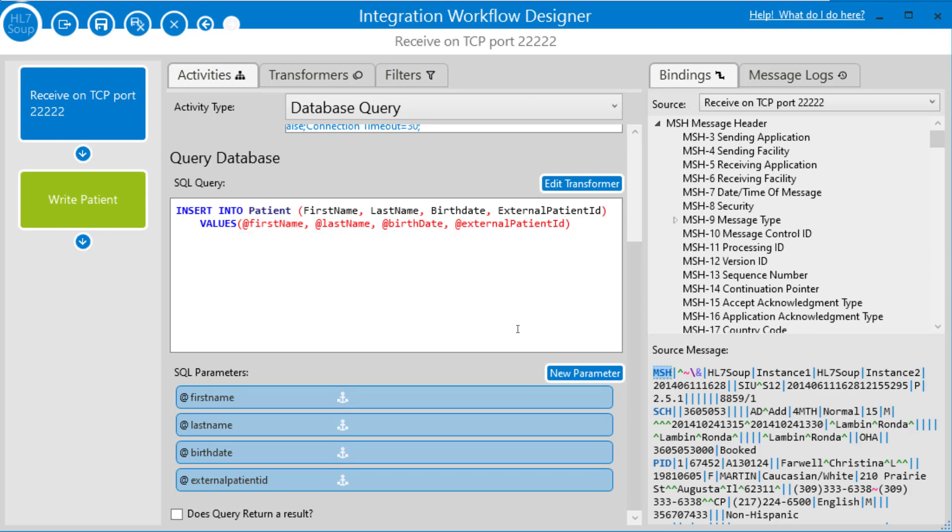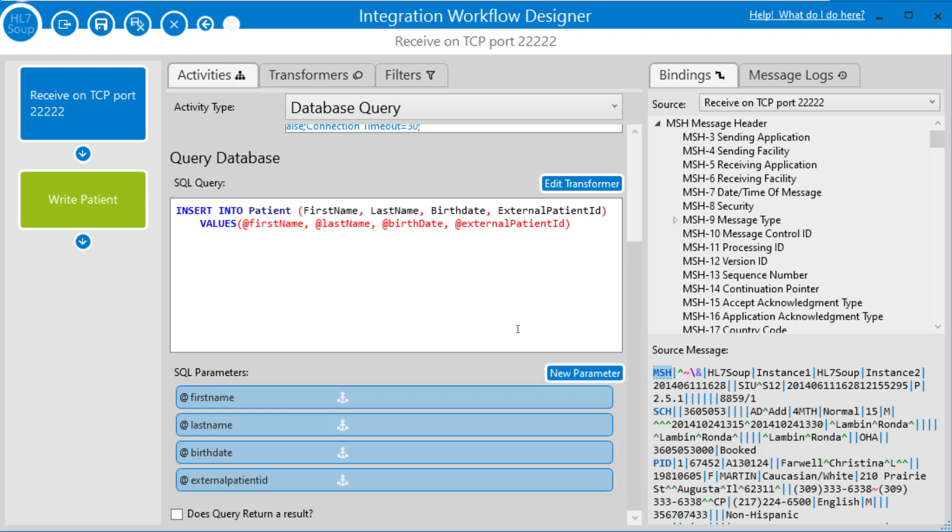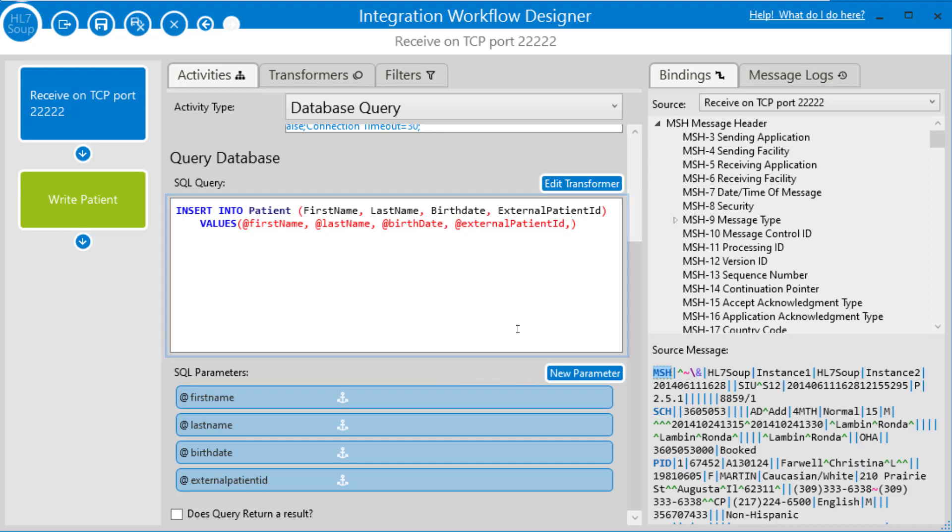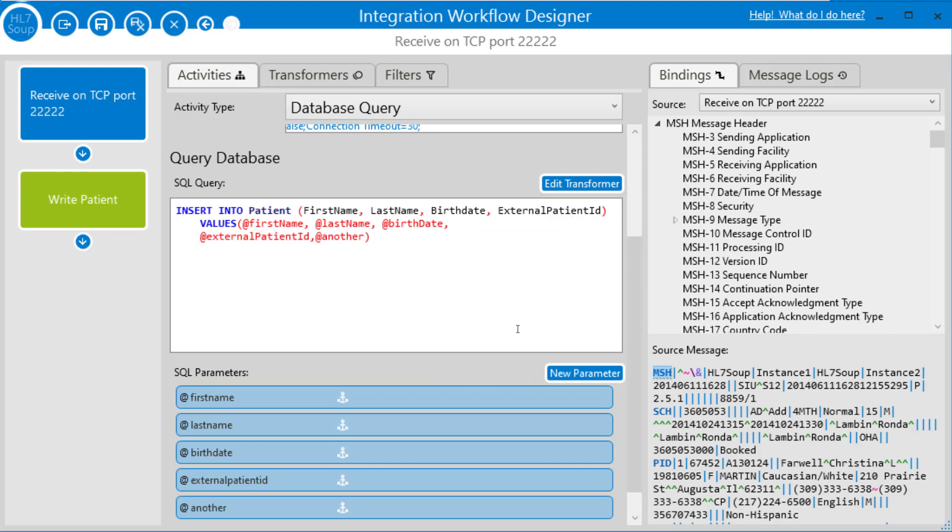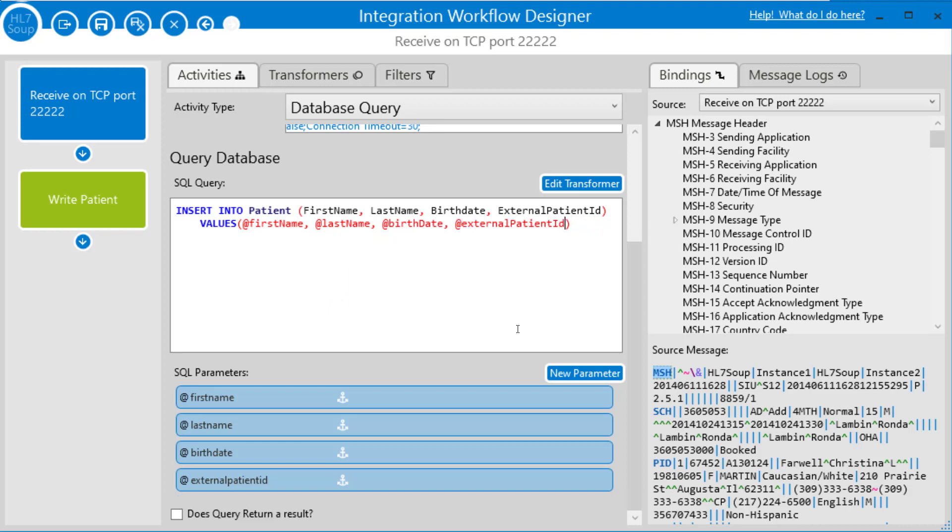Now, because I've added parameters, it's listed the parameters down below here. You could actually put the values directly in your query if you wanted to, but then you're at risk of a SQL injection attack. So if you do need to add your own parameters, either click the new parameter button here, or just simply type it into the query. And you'll see that the parameter is automatically added below. I'll get rid of that only parameter because we don't need it.